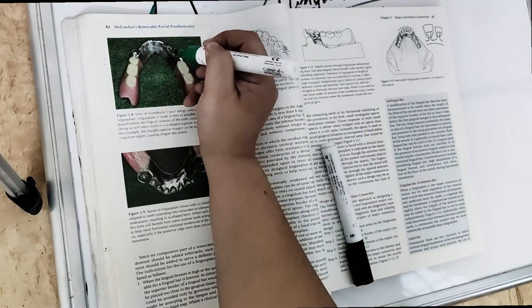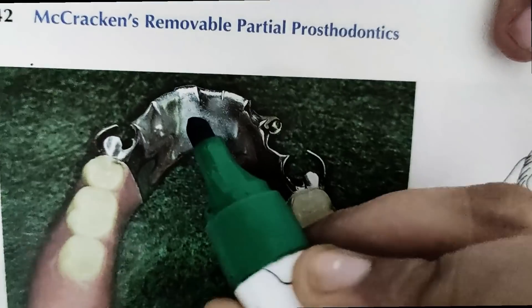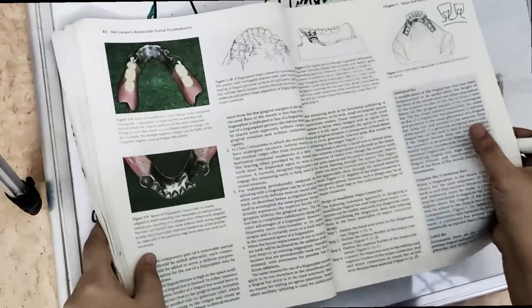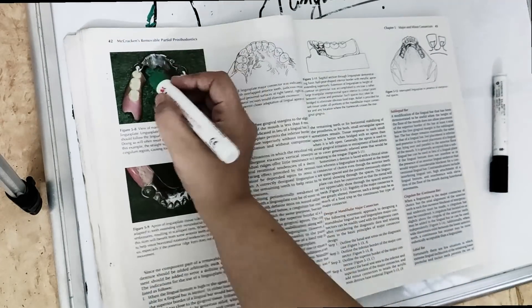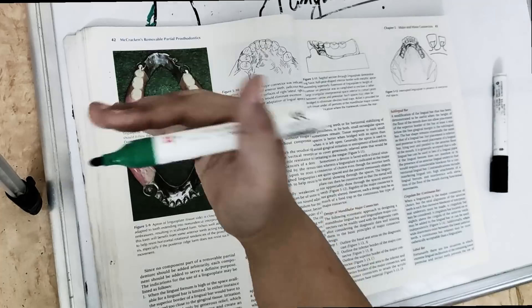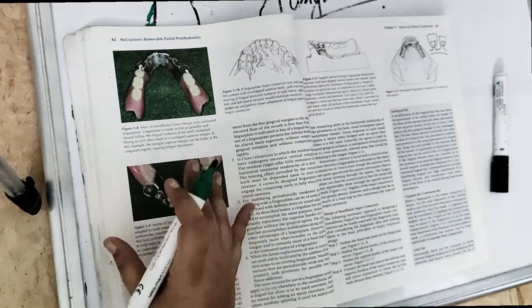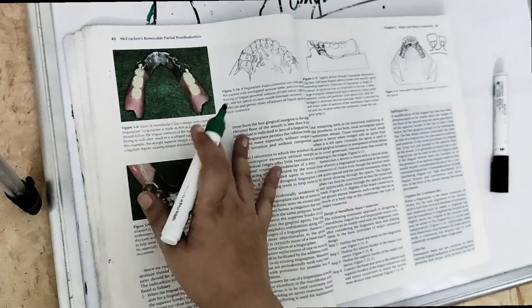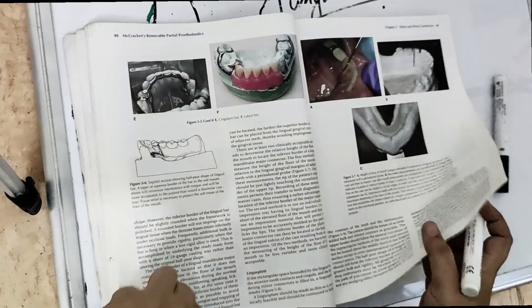The superior border of the lingual plate is a very thin plate of metal with a scalloped border that contours along each tooth. It has knife-edge margins and contacts the teeth just above the cingulum, which reduces the wedging effect.